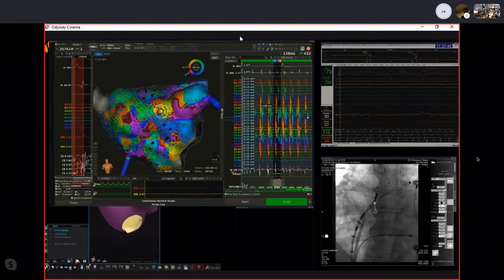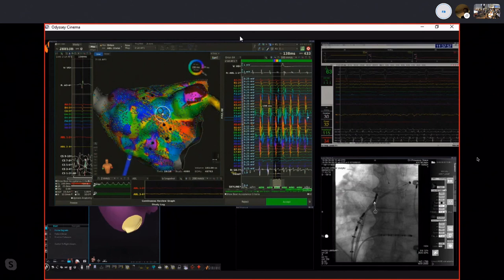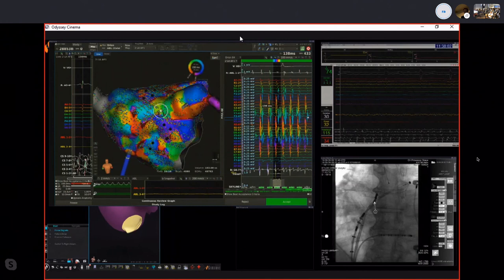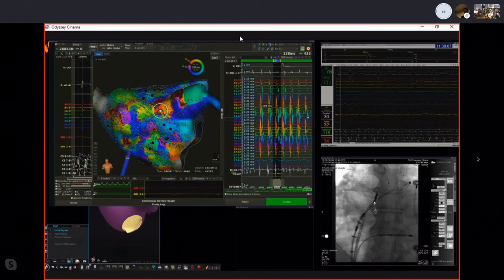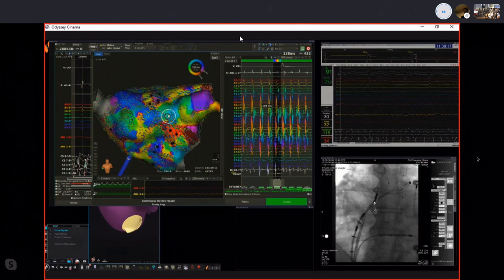This is still a manual and visual interpretation of electrograms and activation mapping. There is work being done on an automatic tool in order to highlight automatically all these areas, but we think that it's pretty much reliable. So for the moment, just before opening again the live session, we ablated three of such spots. This one, but also two other.